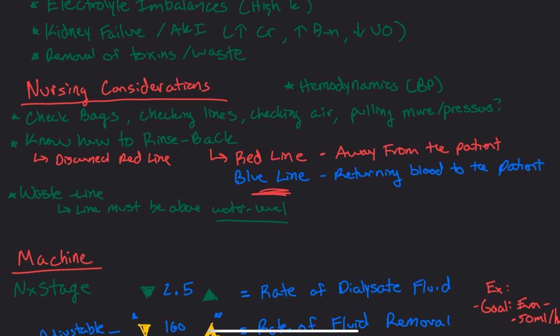That's where you need to be on the same page with the provider and the nephrologist as far as, are they wanting to pull? Maybe it's very important to pull, or they add pressors, or they want to back off on the pull so they can avoid the use of vasopressors. So just clarify that beforehand and make sure everyone's on the same page there.